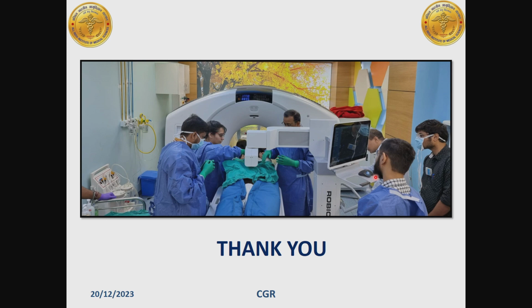Thank you, ma'am. I'll come to the neurology question first. Now, the radiopharmaceutical which we are using here is FDG. As we can see in the various images, it has a normal physiological uptake in the brain. So most of the time, except when it is a recurrent disease, we can definitely guide the neurosurgeons. We can fuse it with the MRI and guide the surgeons where to put the needle. But for real-time PET-CT guided biopsy, the only site which cannot be targeted is the brain. Except for the real time, we can definitely guide whether there is recurrent tissue and which area to proceed with.